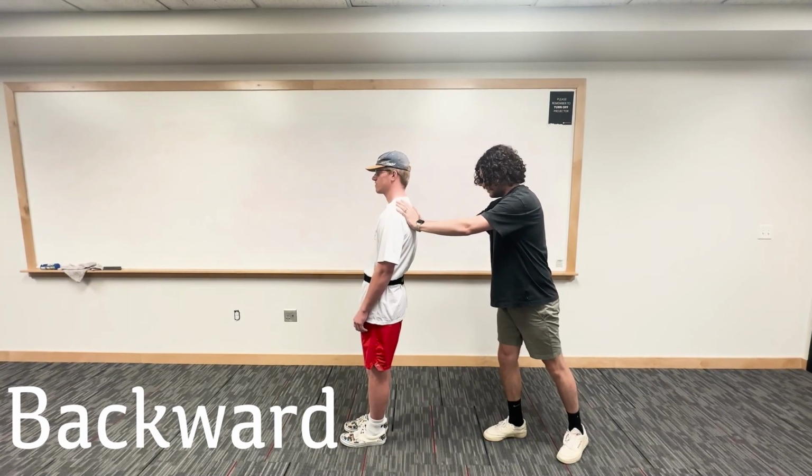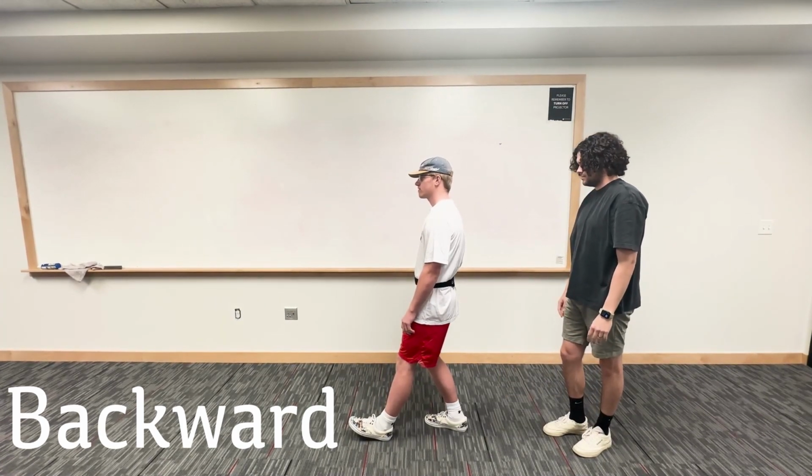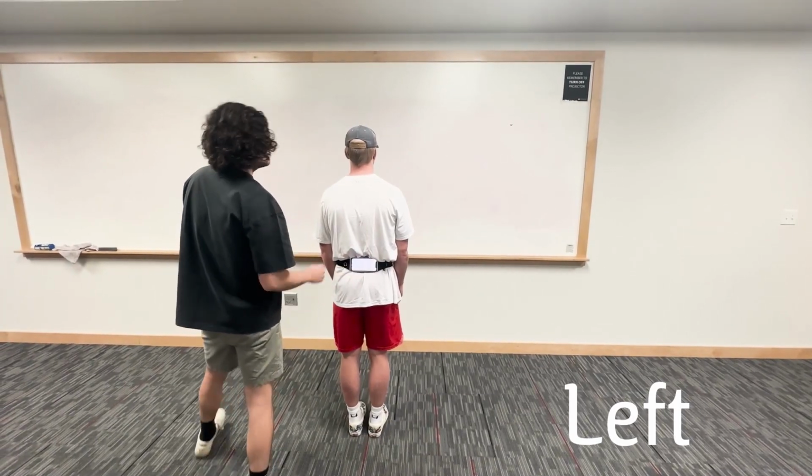Now what we're looking for with the reactive test is the time to stability. The time to stability starts when the patient is dropped and ends when they're stable for more than 1 second.